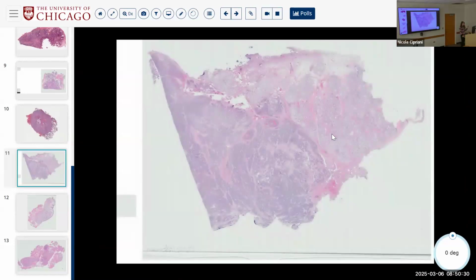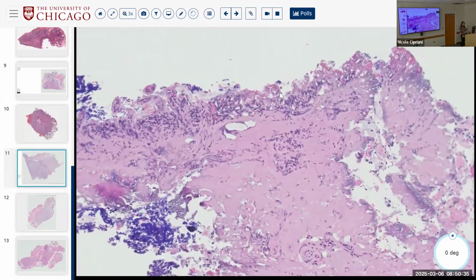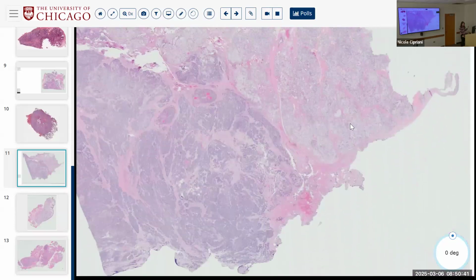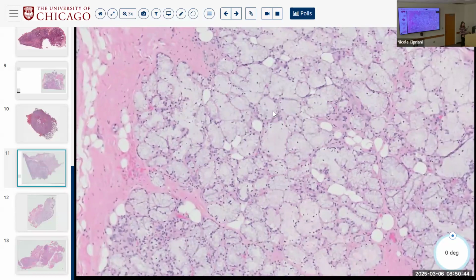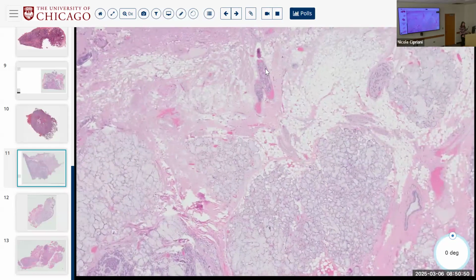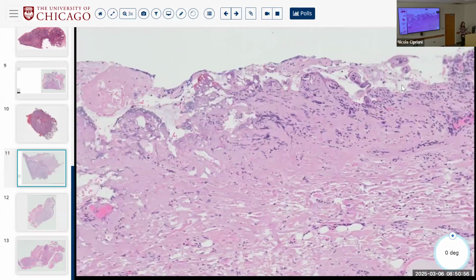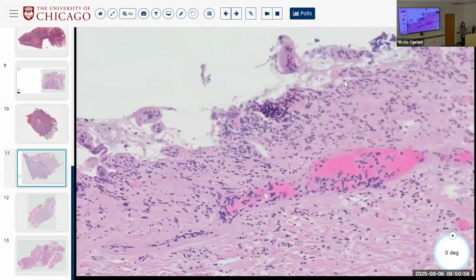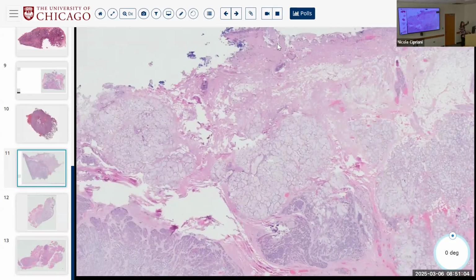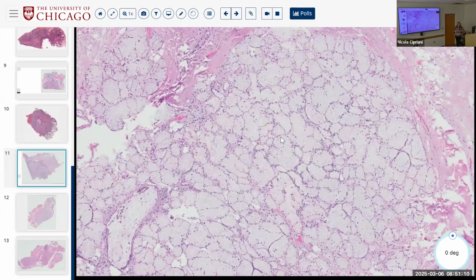All right, now we are in an anatomic site that looks like, I don't know if that was cauterized epithelium or what, but we have a significant amount of mucinous glands and ducts, and I'm going to imagine that this was probably a surface squamous epithelium that got sloughed off. So if we are in a squamous epithelial lined site with a predominance of mucinous glands, what are a few locations that we could be at?